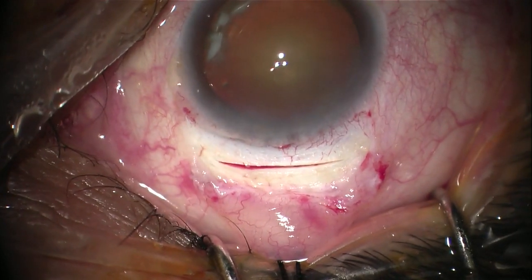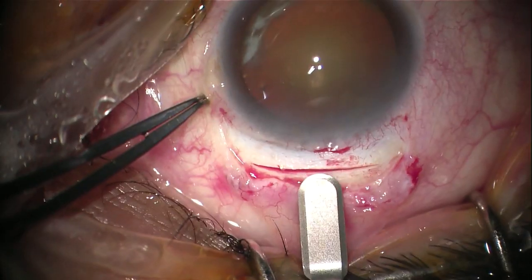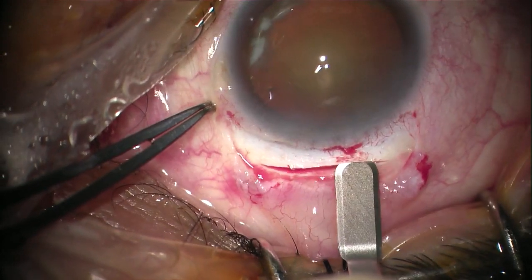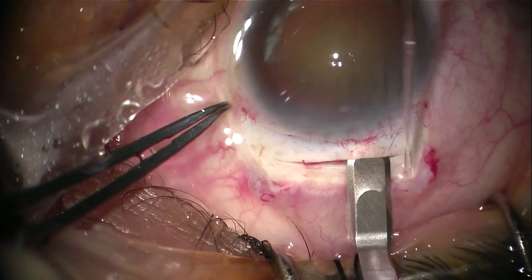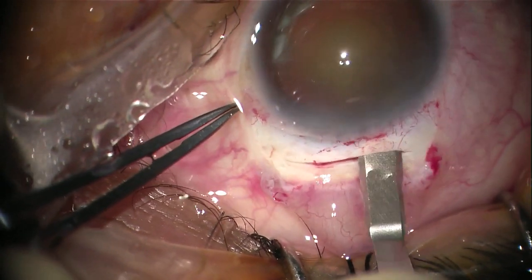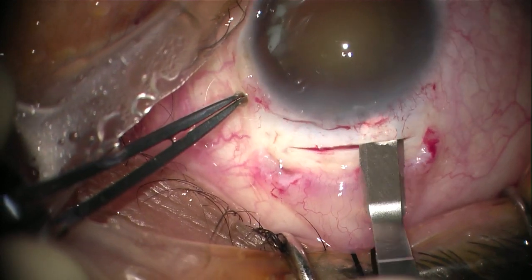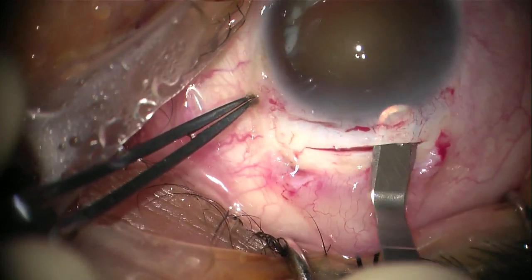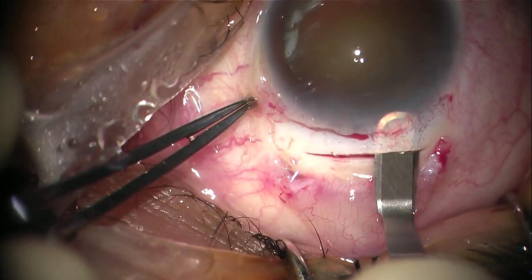Next we start creating the tunnel with a crescent knife. We do not start in the middle of the tunnel — instead we start to the right side if you are right-handed, or to the left side if you are left-handed. This way, if you started at a very superficial or very deep level, you can always abort the tunnel at that side, go to the other side, and start a new tunnel which usually goes above or below the first tunnel, giving you a second chance to continue the surgery with a good scleral tunnel.